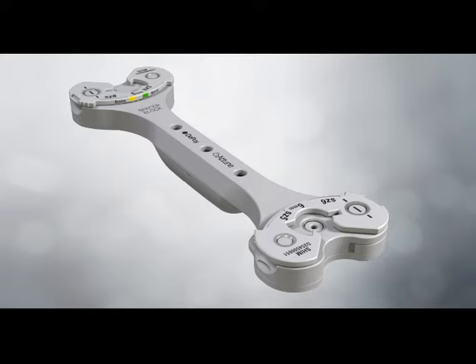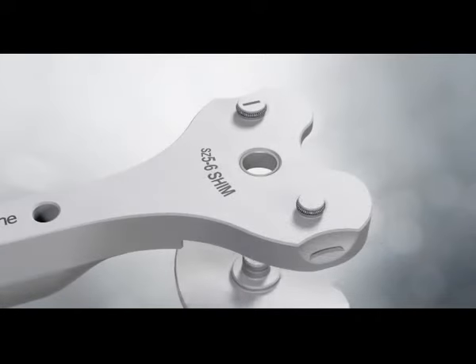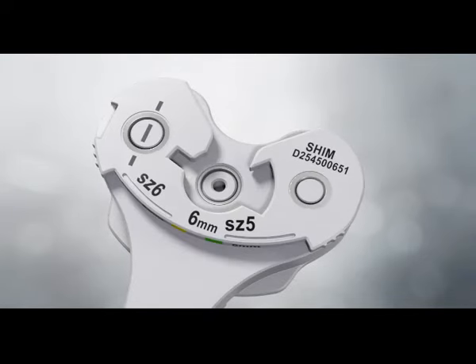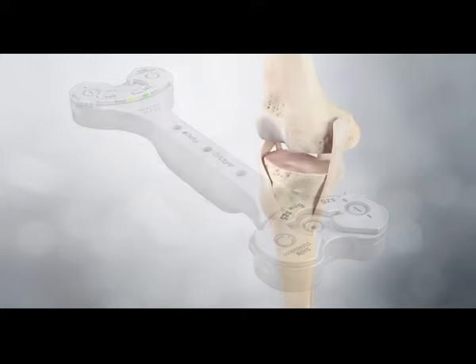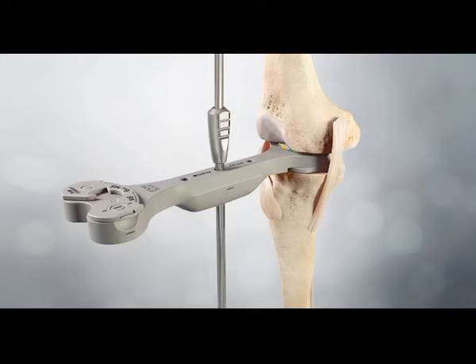The spacer block is designed to accommodate both cruciate retaining and posterior stabilised techniques. To evaluate the PS extension flexion and CR extension gaps, attach the spacer base to the spacer block. Each end can be connected to a different shim to allow sequential evaluation of thicknesses. With the leg fully extended, the spacer block is introduced between the two resected surfaces; it should fit snugly. The extension gap should be rectangular with the leg in full extension. If the extension gap is not balanced, the angle of either the tibial or the femoral cut may be adjusted or soft tissue releases performed to achieve balance.